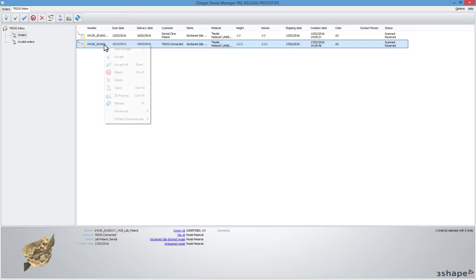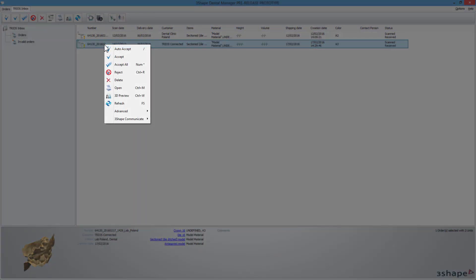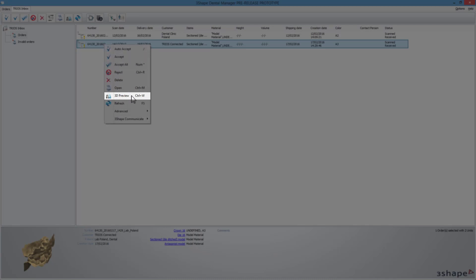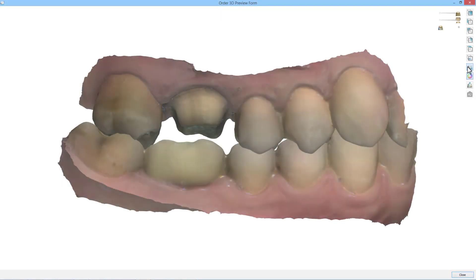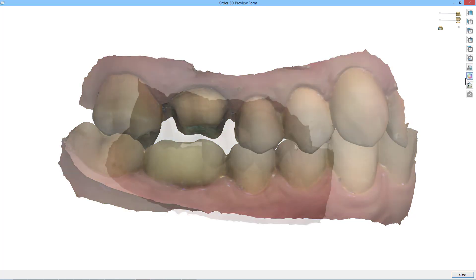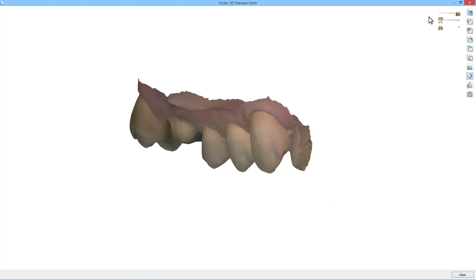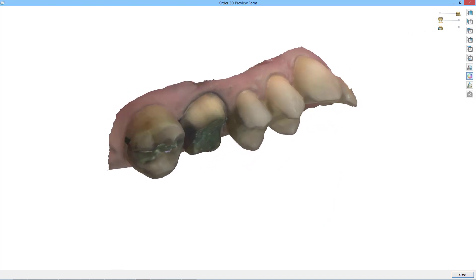When you right-click the selected order, you will have access to all the options necessary to manage the order. One of the most important is the 3D preview tool, which allows you to evaluate the order in a precise manner. You can switch the texture on or off, fade out the antagonist if necessary, or use the 2D cross-section tool, which allows for exact measurements on the selected cross-section plane.